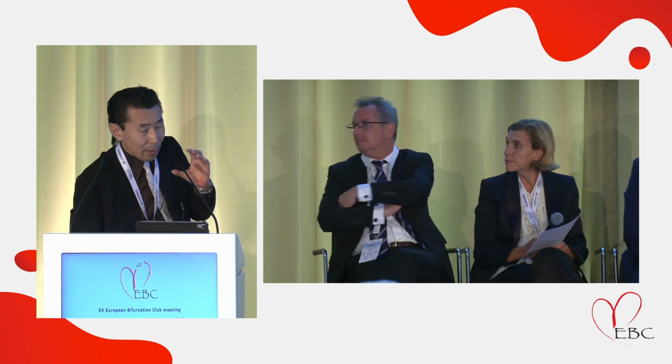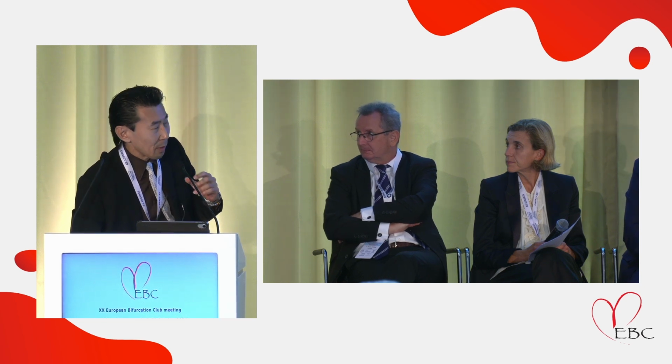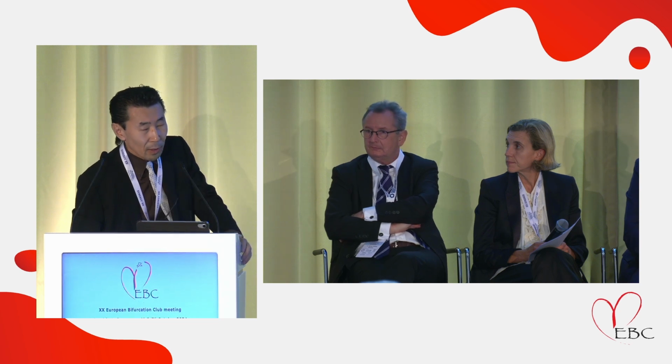Actually, superficial calcification is sometimes a little difficult to evaluate by CT, so sometimes it is difficult to determine the position of the calcification. However, the proximal part of the calcification is very big. So whether this point is the deeper side or superficial is not so big a difference for the heavily calcified lesions.